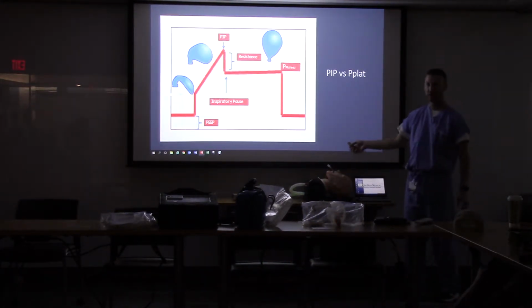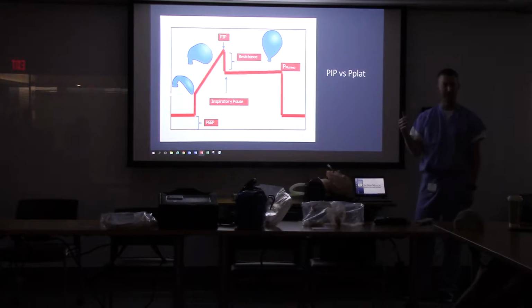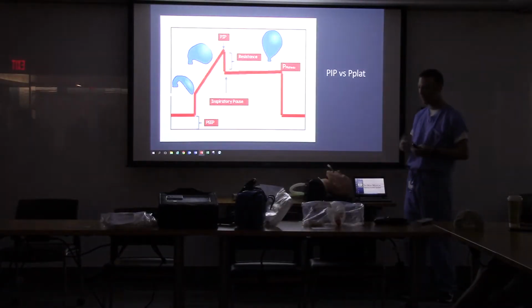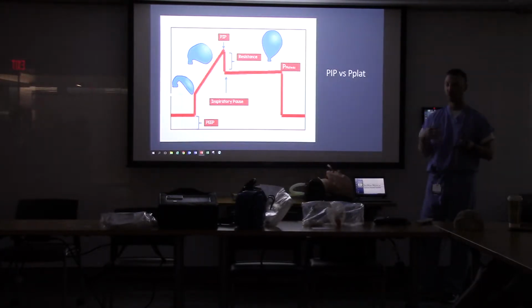So PEEP, hopefully everyone at this point is aware of PEEP, and that's just as you breathe out, you have a positive end expiratory pressure that's still remaining in the chest. The way that you can deliver that on your own right now is you breathe out through pursed lips. That's the point of pursed lip breathing, to create internal PEEP.